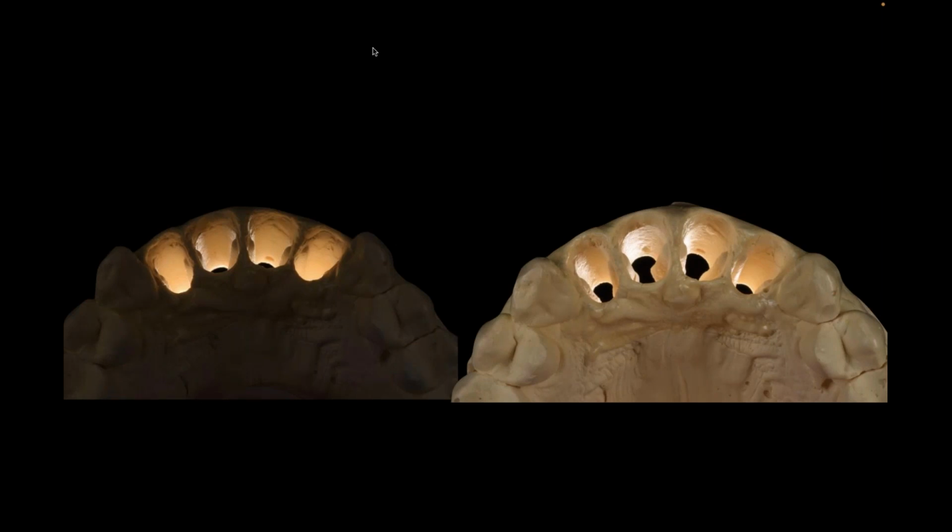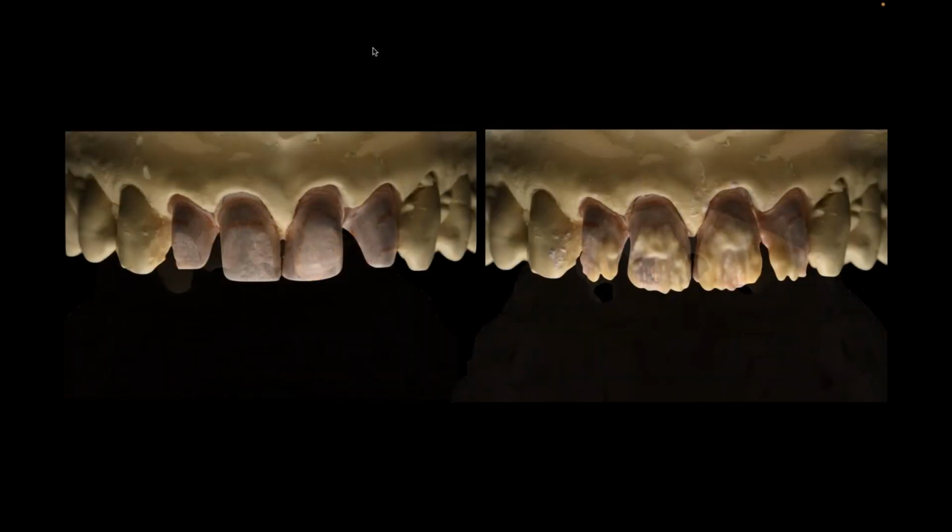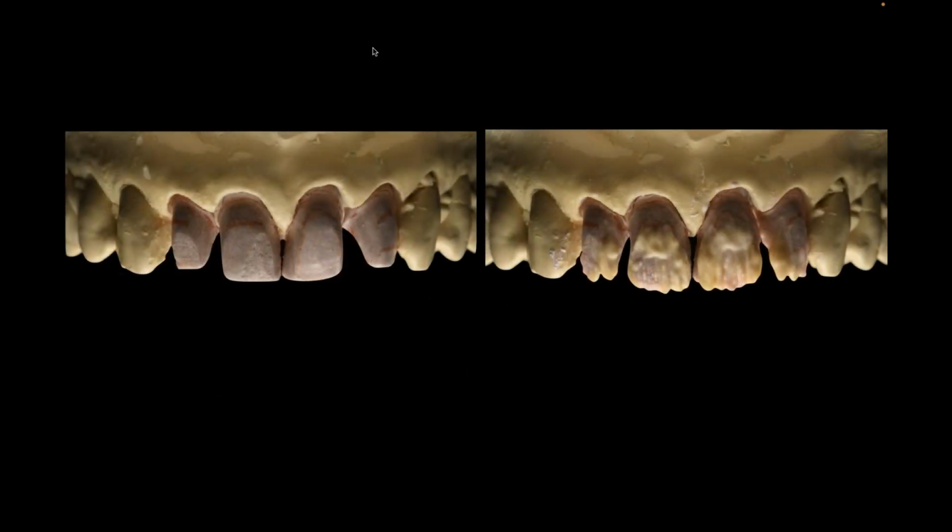Then I have control because I know I'm going to finish with 2 to 5/10 of enamel, but I might have 3, 4, 5/10 internally that I can now work through with dentins and mamelons and other materials. So it gives me the best of both worlds. Filtering what I need to filter, but controlling the internal canvas that I'm working on.